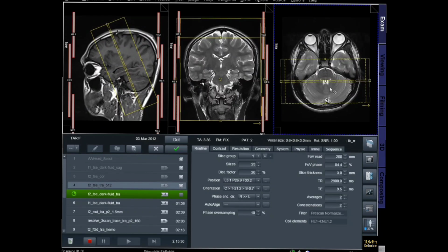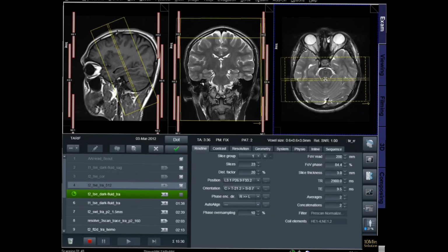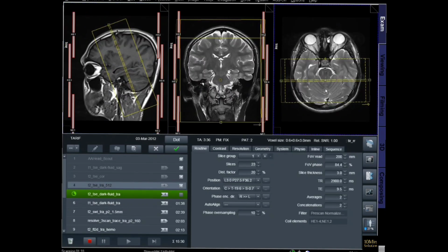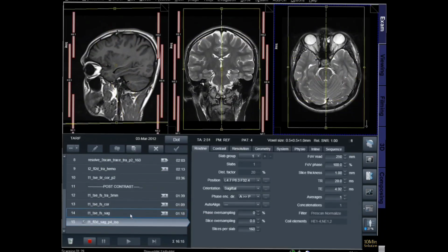Clinical importance. MRI with epilepsy protocol is extremely valuable in evaluating patients with drug-resistant epilepsy and in planning epilepsy surgery. It helps identify epileptogenic lesions such as hippocampal sclerosis, cortical dysplasia, tumors, vascular malformations, and infections.